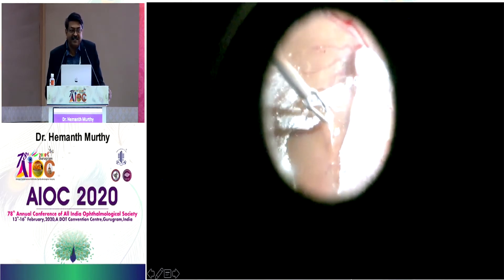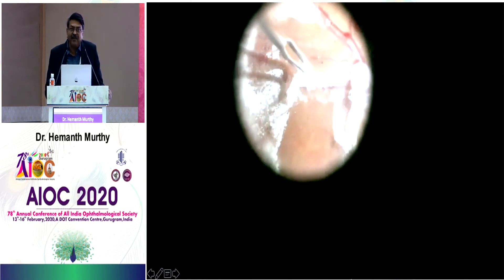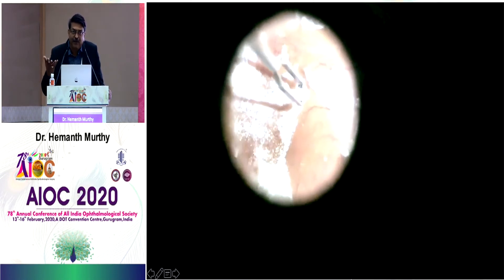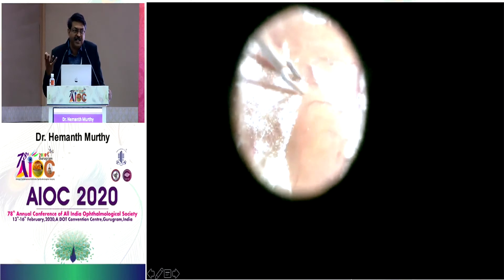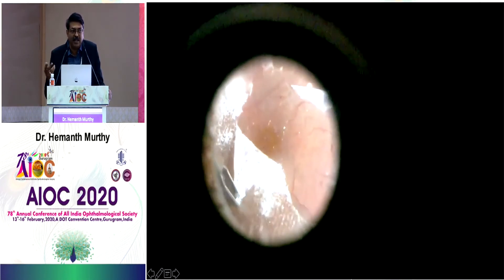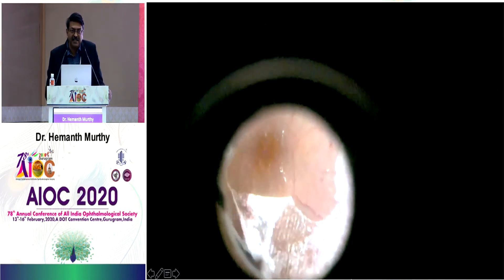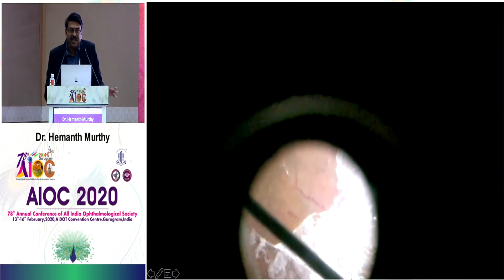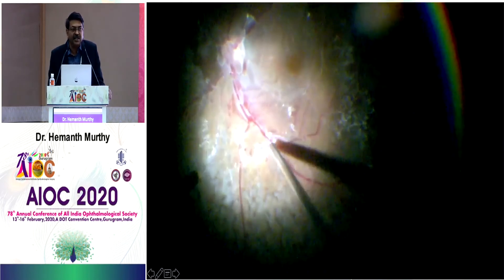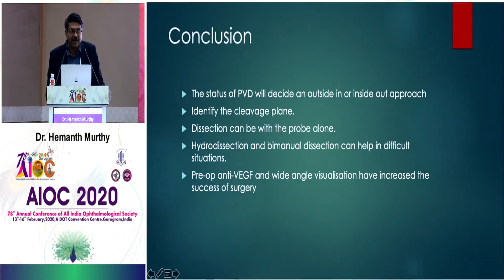You can see that the entire vitreous is present at the back — what looked very clear has not actually been completely taken off. Patients come back with recurrent vitreous hemorrhage because the scaffold is still present: proliferation occurs, they bleed, and you wonder why nothing works after your vitrectomy. Remember, you need to stain and remove all of this before you can say your surgery is complete.